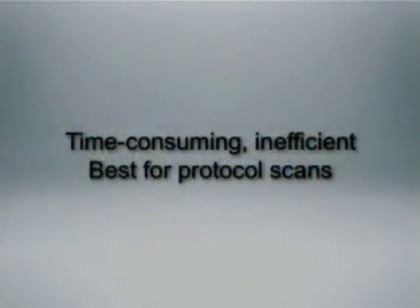The trouble with doing it on the machine is that it's time-consuming and relatively inefficient. That is, when you're using the machine to process a 3D volume, you're not using it to scan another patient, and you're wasting time, and time is money.